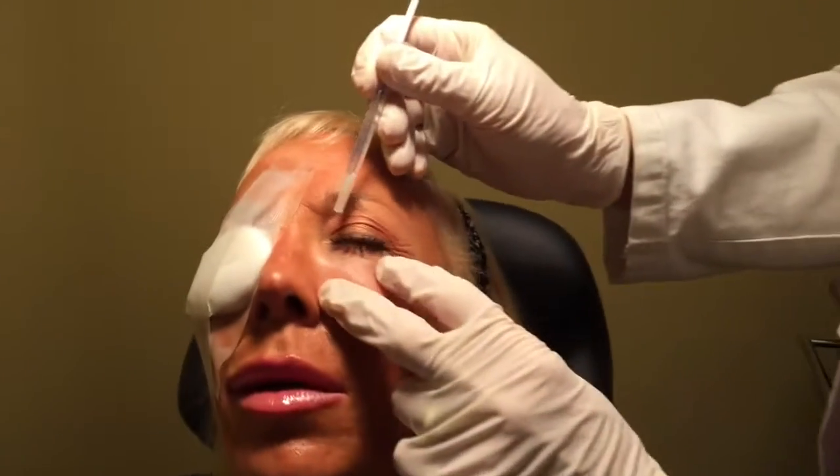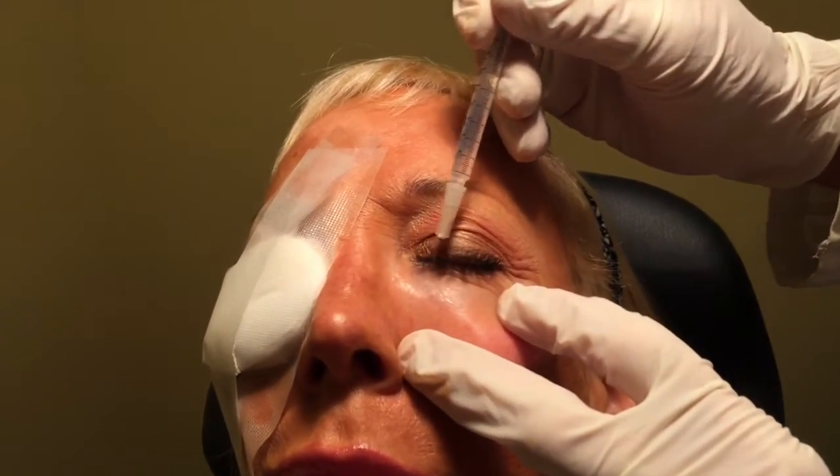Okay, so what we were just noticing here is we think we have a little bit of the Tyndall effect, a blueness cast underneath the skin. So we're going to inject here all the way up into the tear trough, and that's probably what they were trying to do back then, to help camouflage the fullness. Unfortunately, in people who have real fullness in their lower lids, it usually doesn't work that well.